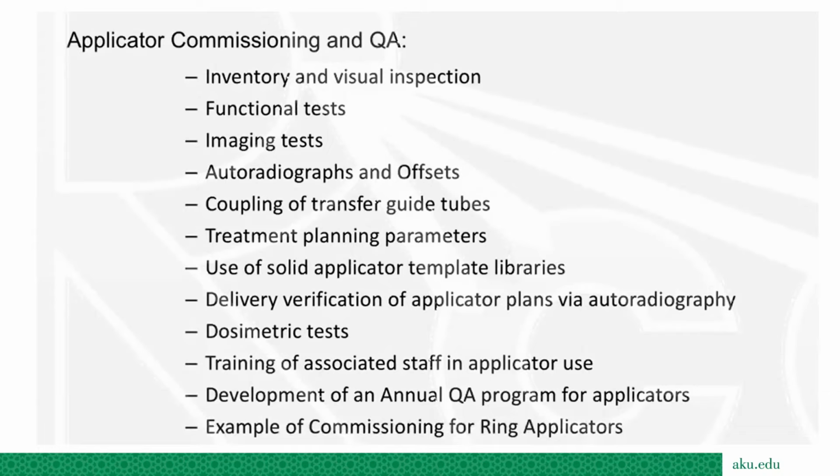Training of staff, of course, is very important. Development of an annual QA program for the applicators. Each applicator should have a QA program, and we'll see a little bit about this in the following slides. And in the last, an example of commissioning of a ring applicator. We have published a paper about this as well, and we will touch on this in a little detail.